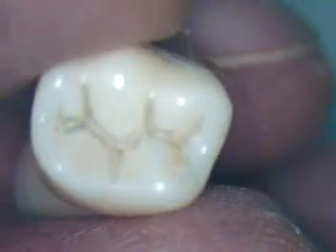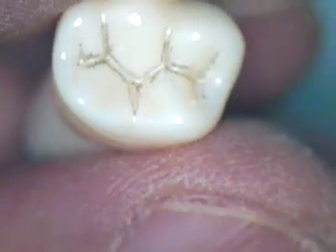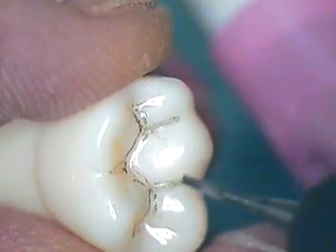That's our outline preparation today. Let's get right to it. As we explained in class, make sure you're on the second notch — that puts you right about a 4. I've got a 699 bur, that's the smallest diameter. I'm going to go over my suction.